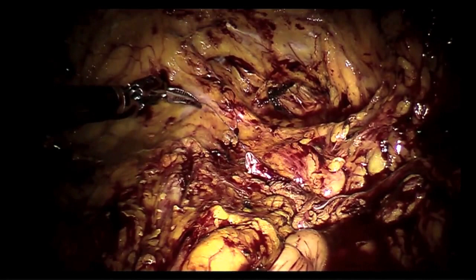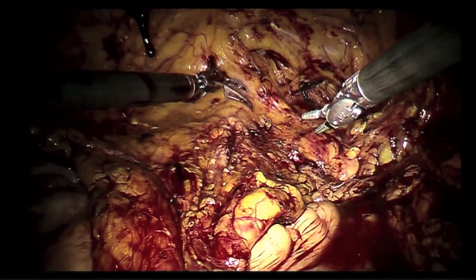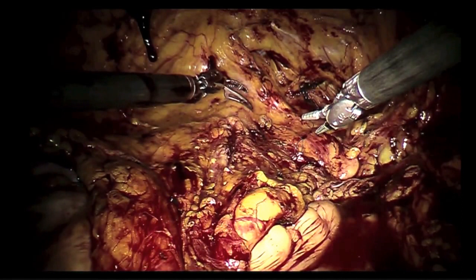No, first I want to just put the distal stitch, just to anchor it. Beautiful. What do you think? Good job, actually. So the anastomosis is no different than open surgery, same. Right? So your point is very good. What is the advantage? We'll see. But at least the basic aspects.